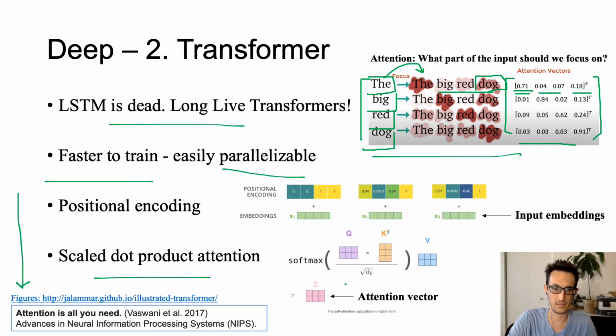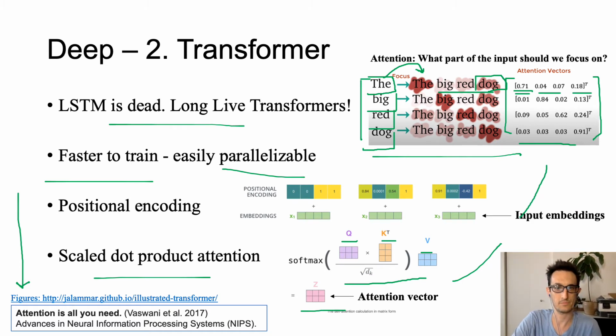This is done through this formula here, where we effectively use the inputs to the network to come up with a query, a key, and a value that are learned by the neural network architecture, and then the result is this Z matrix, which corresponds to these attention values.